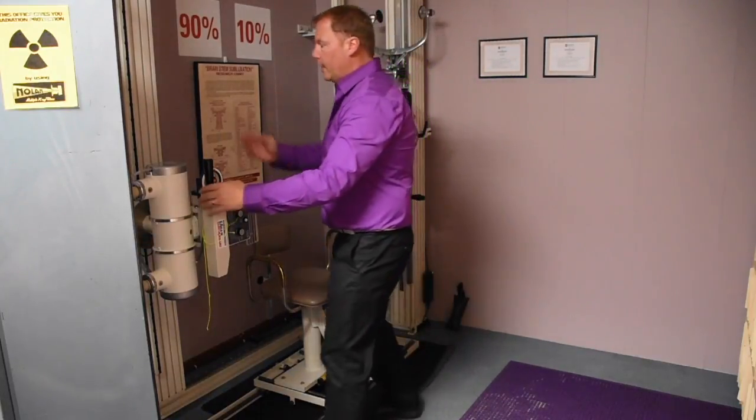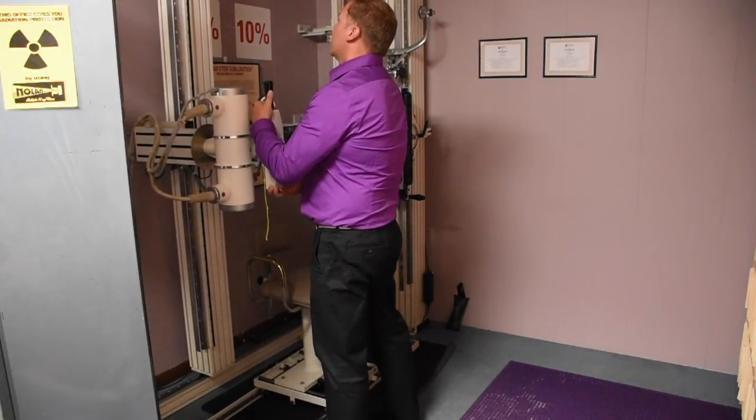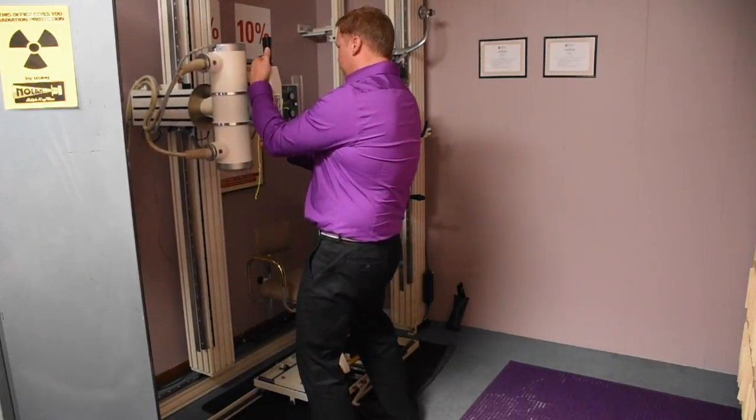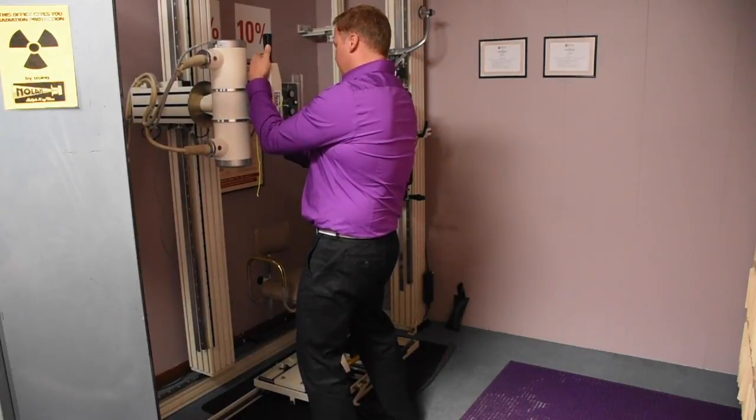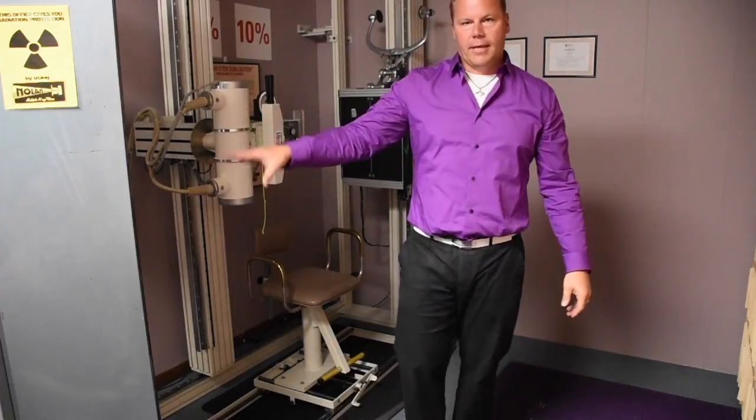Bring the tube back to our 40 FFD and line it up just like that. Make sure we're level at 90 degrees so we're starting correct. Then shut the console off.